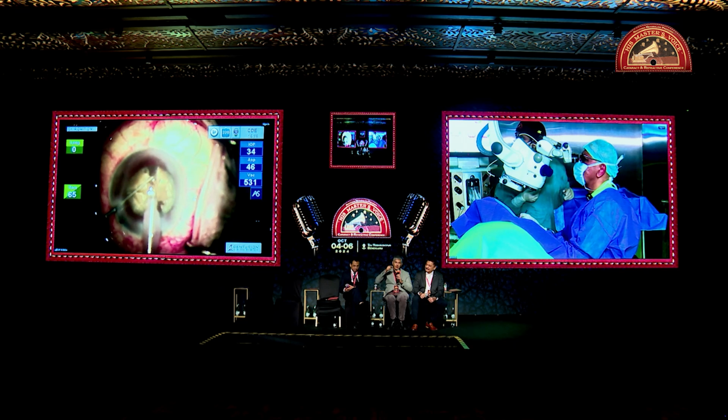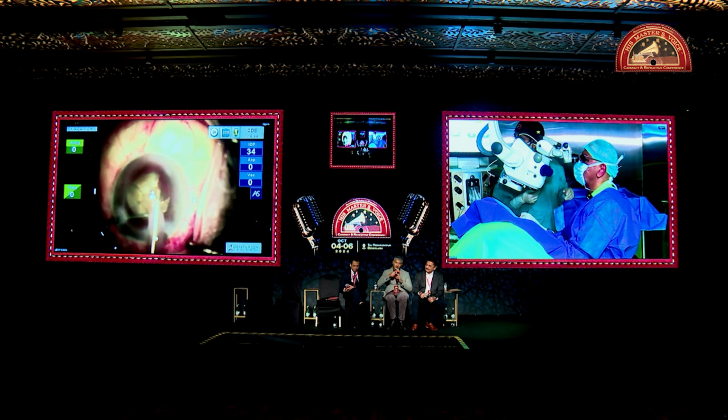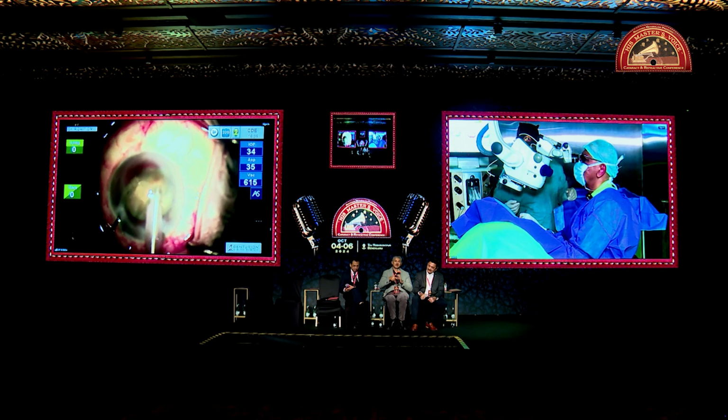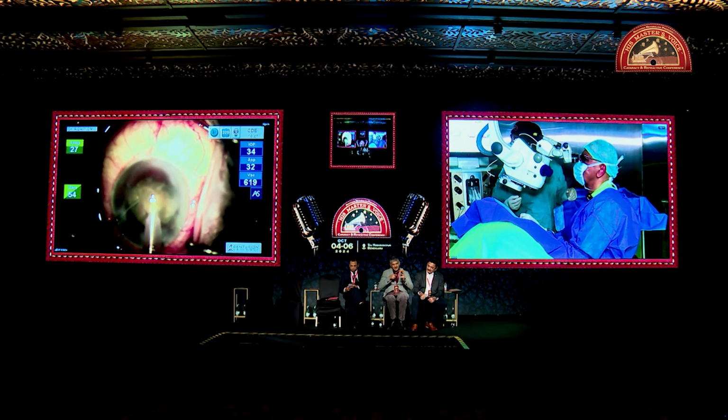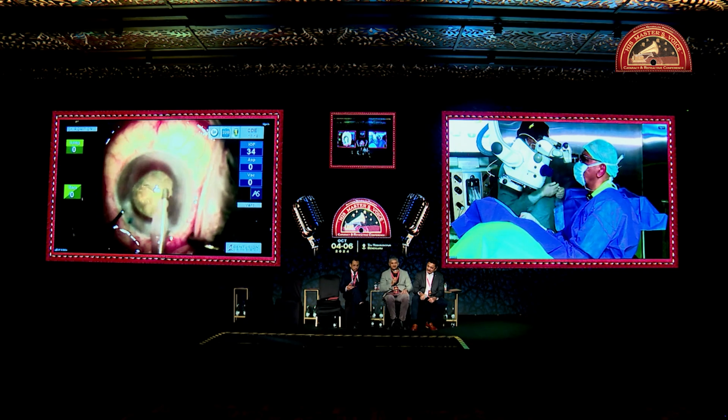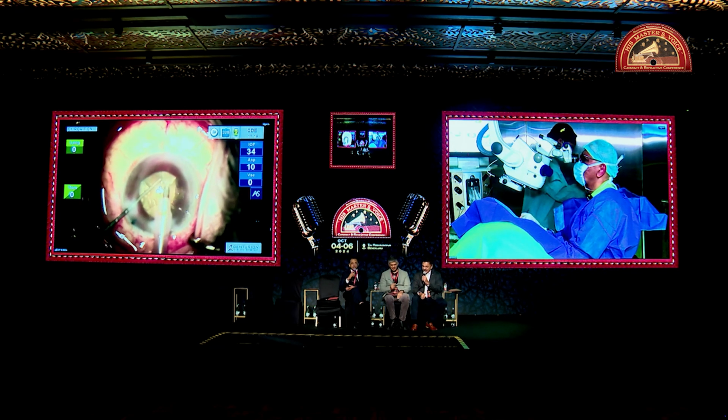You have to bury deep enough, up to the sleeve. So this is like 4.5 millimeter thickness. You have to be at least 2 to 2.5 millimeters into the nucleus. And your chopper has to be at the same level, and then it will split. You have to do the lateral separation because the fibers are very tenacious. The 2 pieces are totally separated.